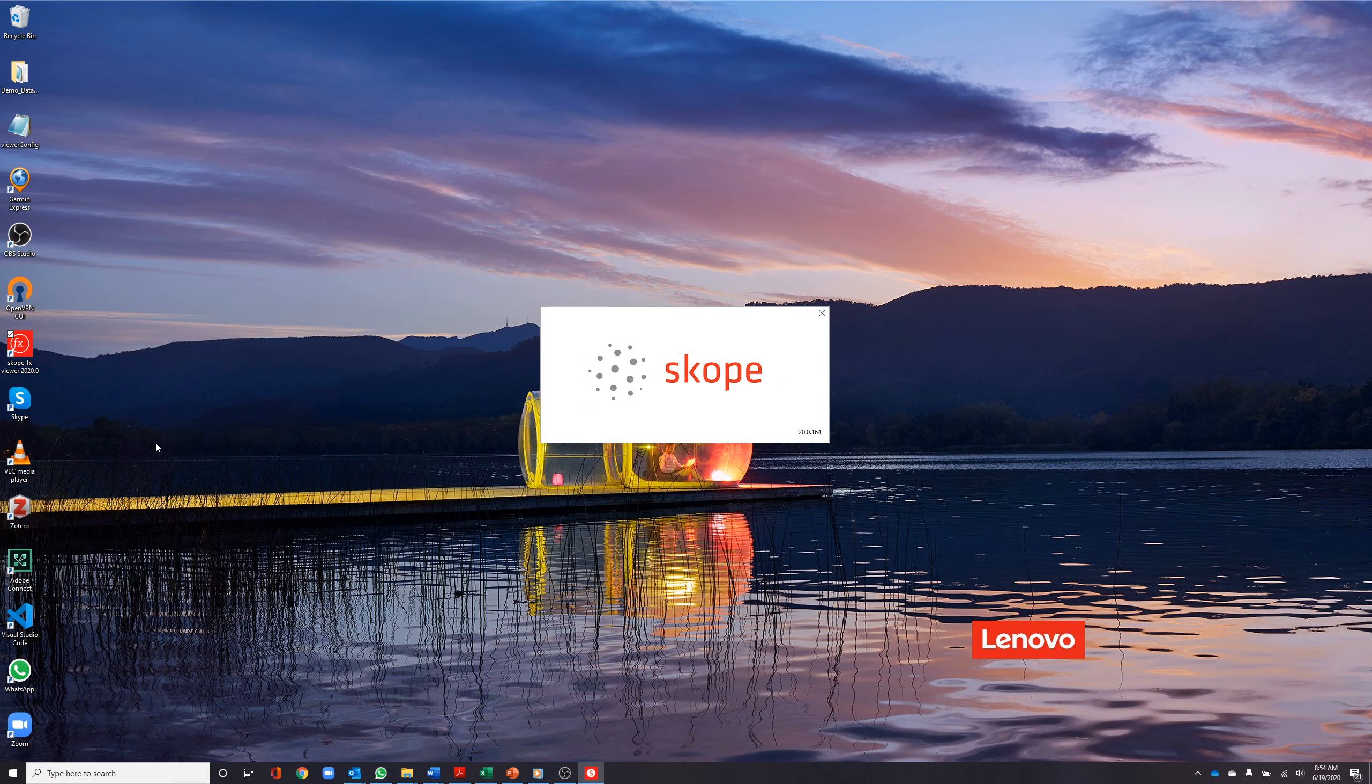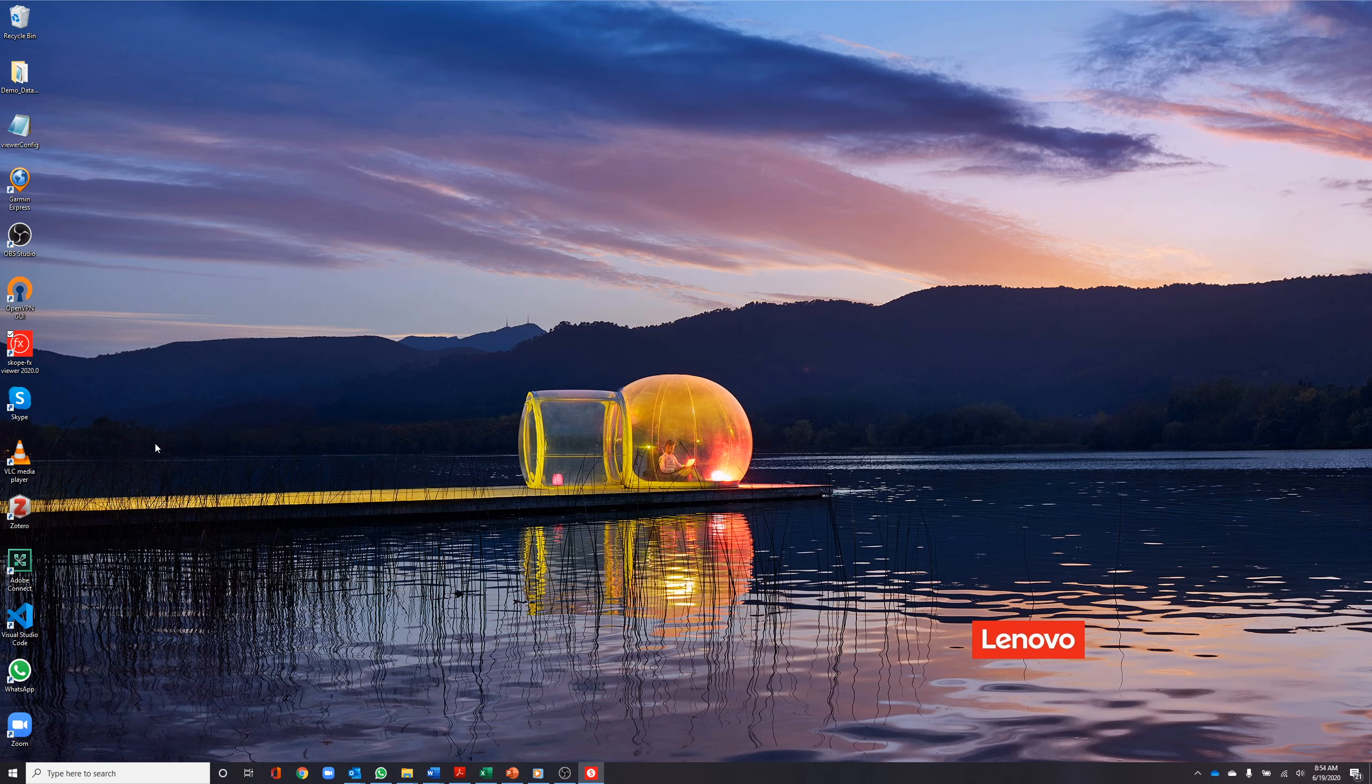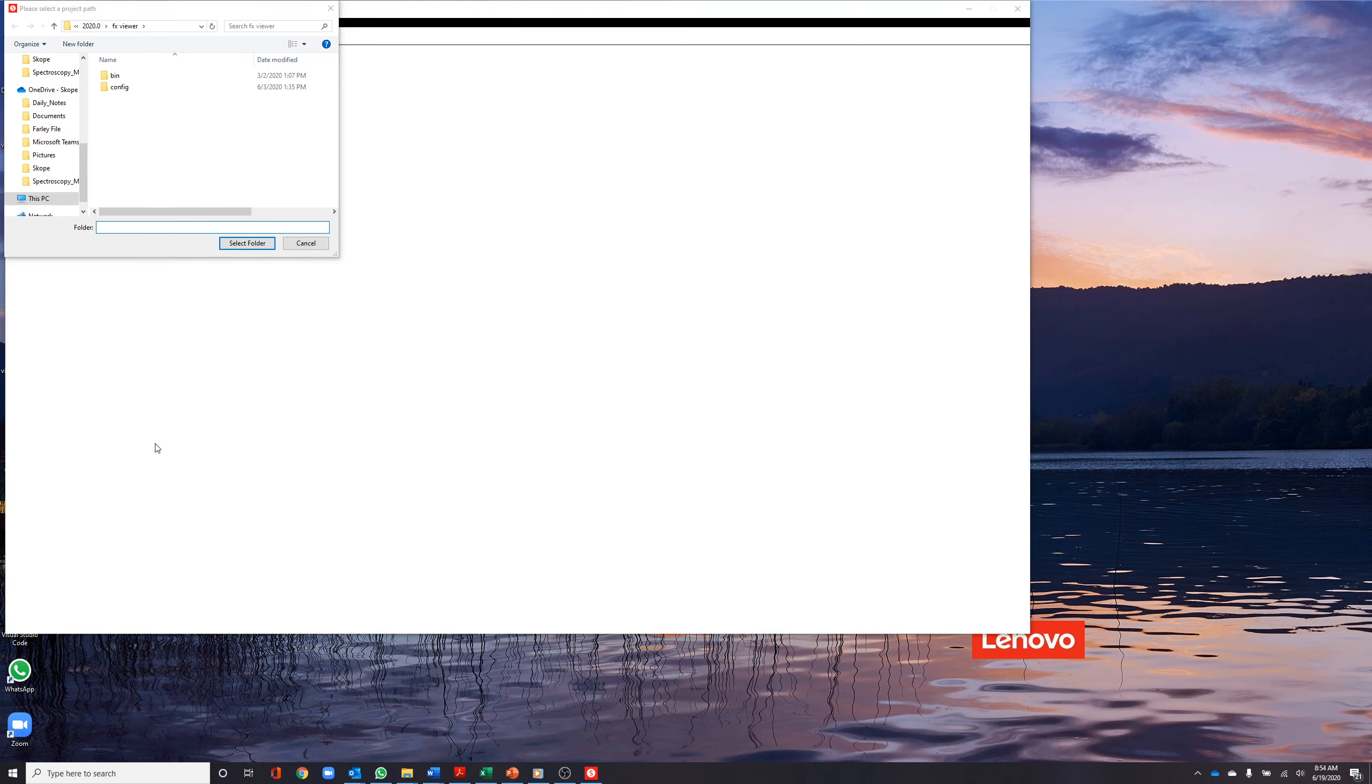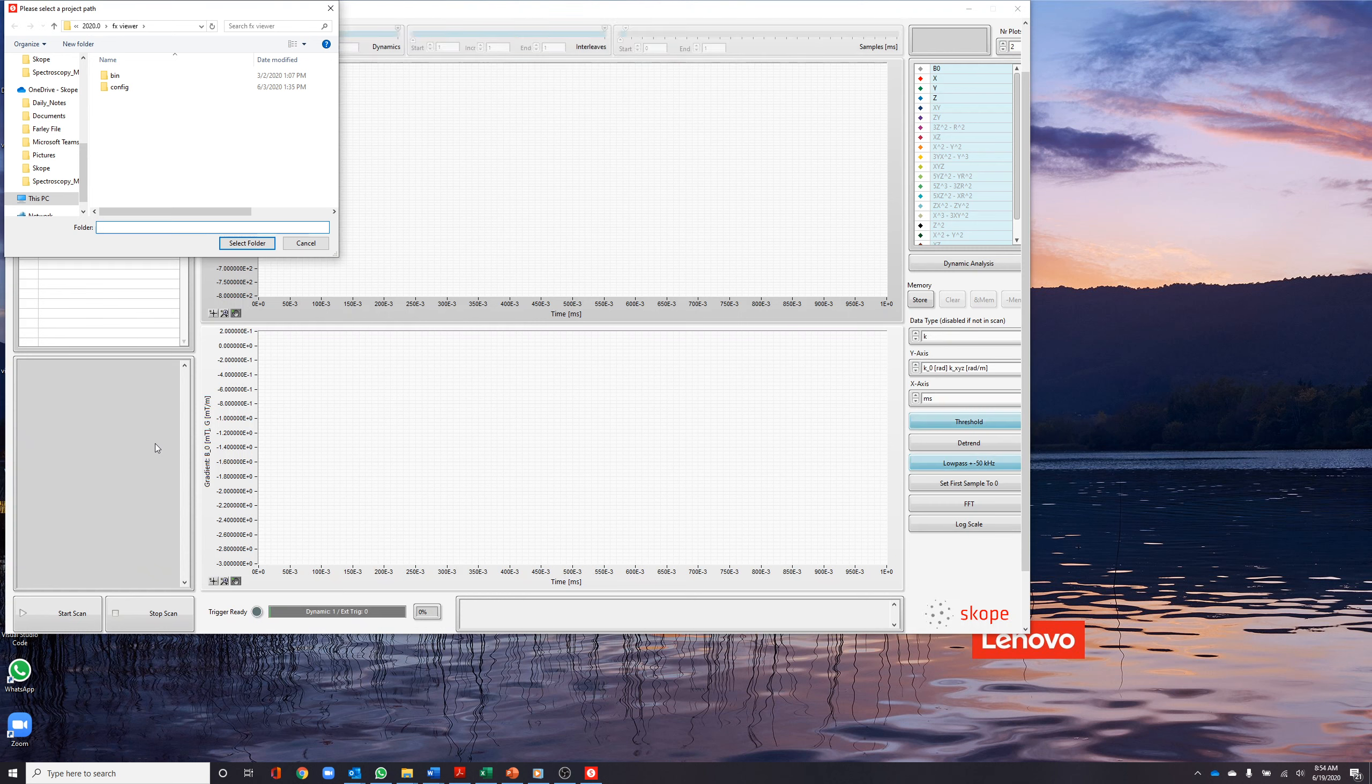ScopeFX is the system for capturing and visualizing field dynamics using NMR field probes. Today in this demonstration, we will show how to visualize previously captured data and demonstrate the functions of the user interface.